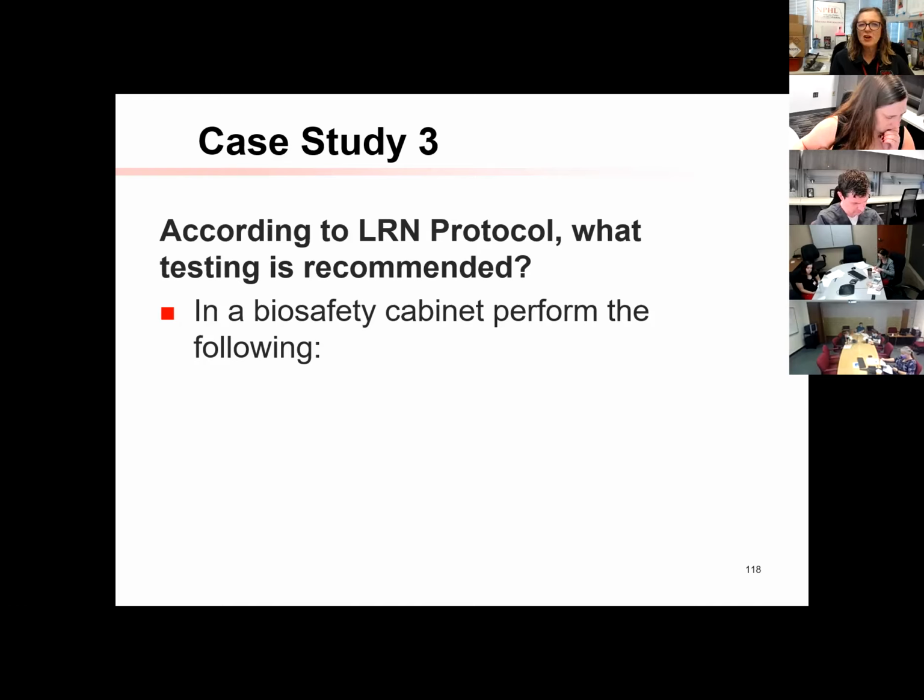And that might not be in that chart of the bench book that I had you print, but I kind of talked about it. Anything that's not growing on MacConkey is probably not a gram negative rod. See if that helps. So now, all right. If you have growth on chocolate and blood, what part of the summary pages are you going for? And tell me what organisms fit in that family. So what two organisms would fit in this family?